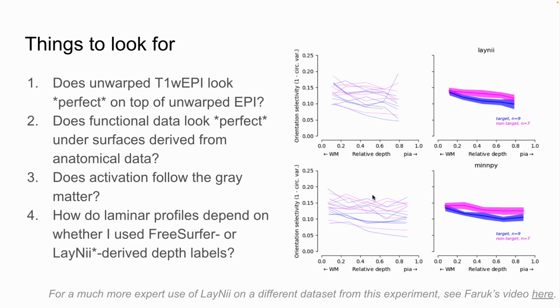The right answer here is a U-shaped function, where the input layers have low selectivity, and then the deep and superficial layers, due to cortical processing, have high selectivity. That's the ground truth. We know this is true. I was trying to recover the ground truth of this experiment to convince myself that I'm doing science. We saw hopeful tips up, and if viewed with the eyes of faith, you could maybe see a U-shaped function. There is no U-shaped function there.